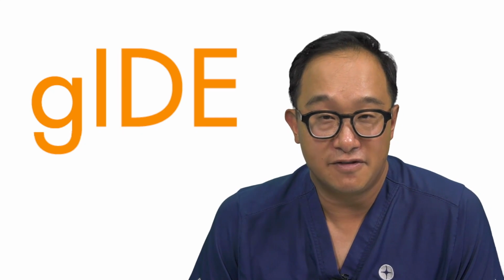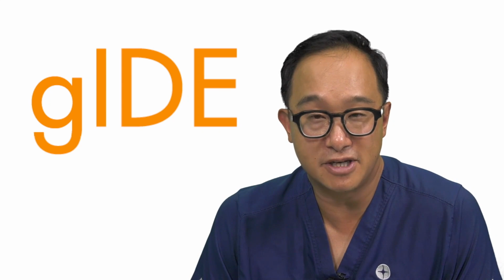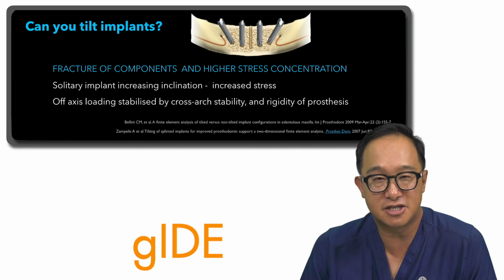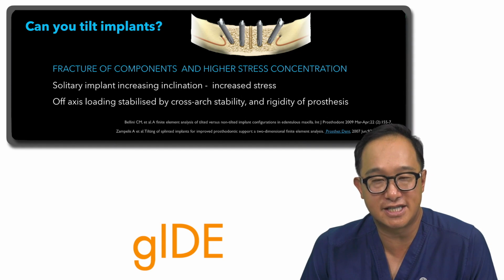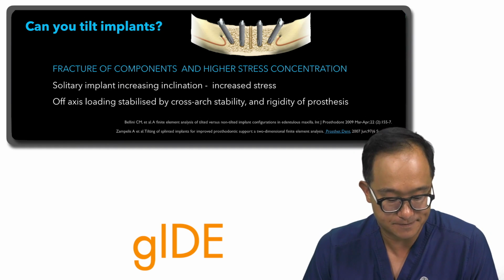Many authors have looked at the finite element analysis of the stress concentration being applied, and they found that for fracture of the components and the stress concentration, in solitary implants, yes, it would be increased by having the inclination and angulation. It would be an increase in stress. But in these sorts of full arch rehabilitations where you are splinting your implants together and having cross arch stability, there's really minimal fractures, minimal change in that stress concentration compared to implants placed axially.